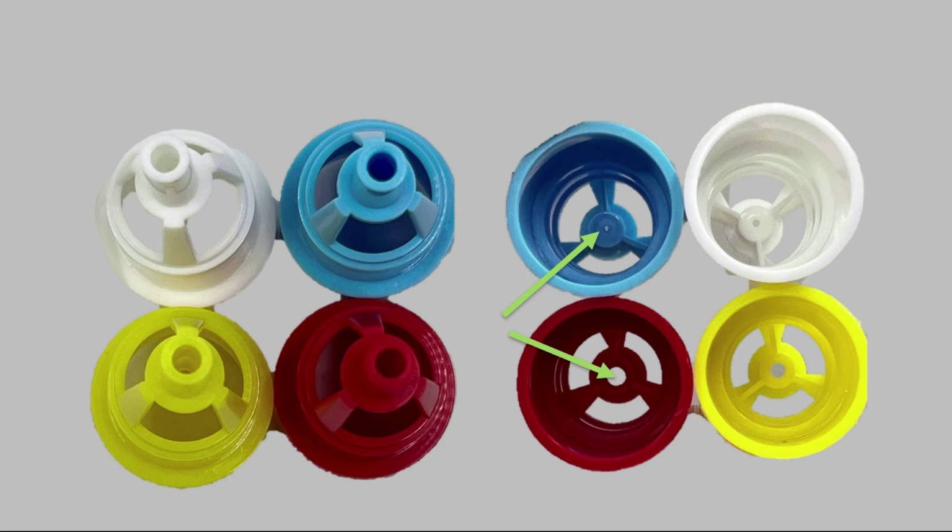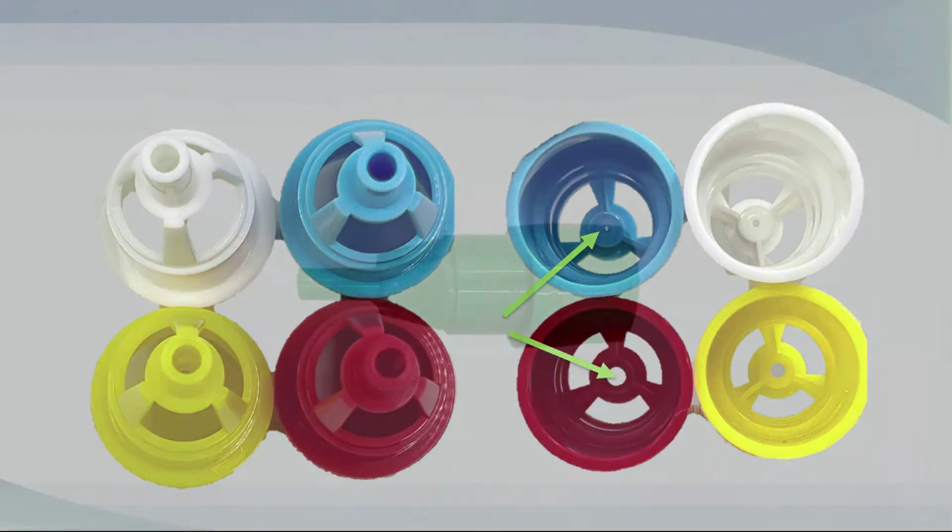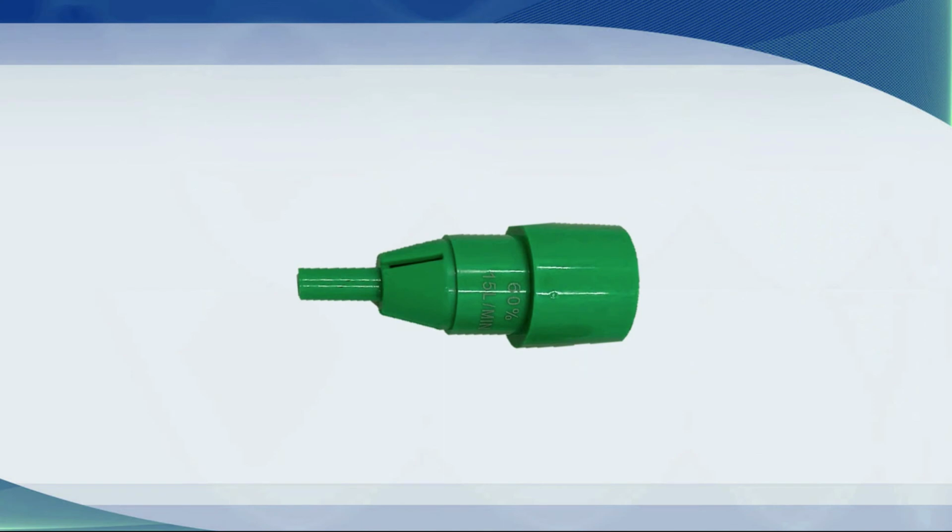The smaller the hole, the lower the flow, the greater the Venturi effect. And you can see that that hole gets a little bit bigger on the white, 28%, bigger again on the 35%, but the 40% is fairly enormous in comparison. This is a 60% oxygen Venturi device. It's demarcated by its green color, the narrow slits on the side, and the labeling that states that you give 15 liters to achieve 60% oxygen.